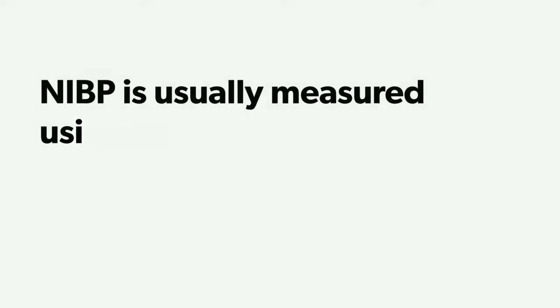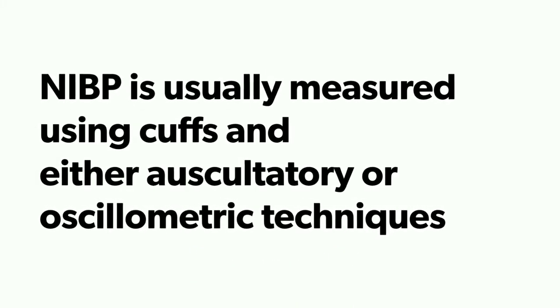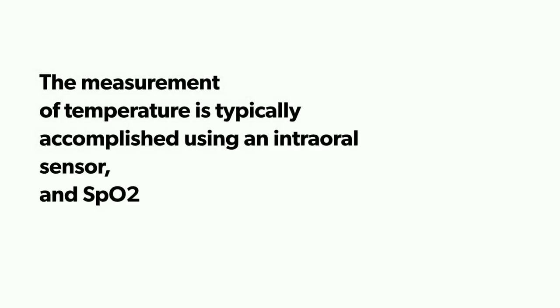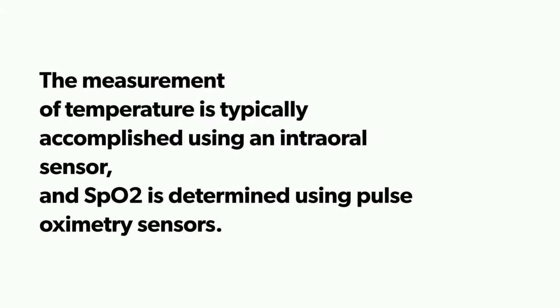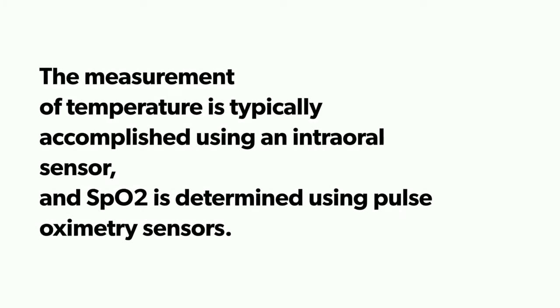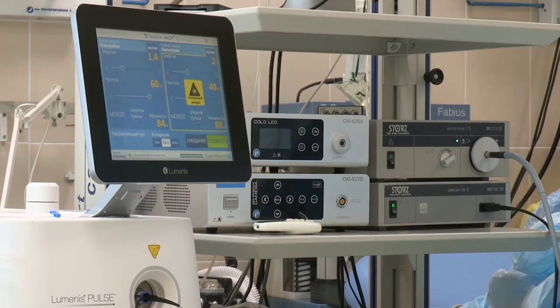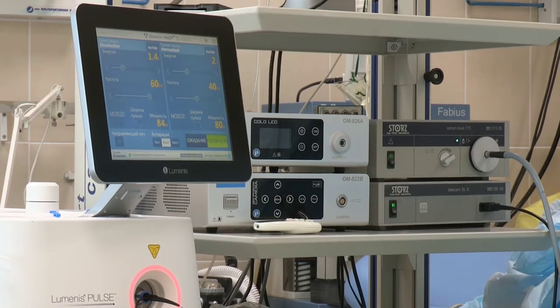NIBP is usually measured using cuffs and either auscultatory or oscillometric techniques. The measurement of temperature is typically accomplished using an intraoral sensor, and SpO2 is determined using pulse oximetry sensors. These monitors typically consist of portable or mobile electronic units that facilitate the movement from one location to another. The monitor may be connected to the line or powered by internal batteries.